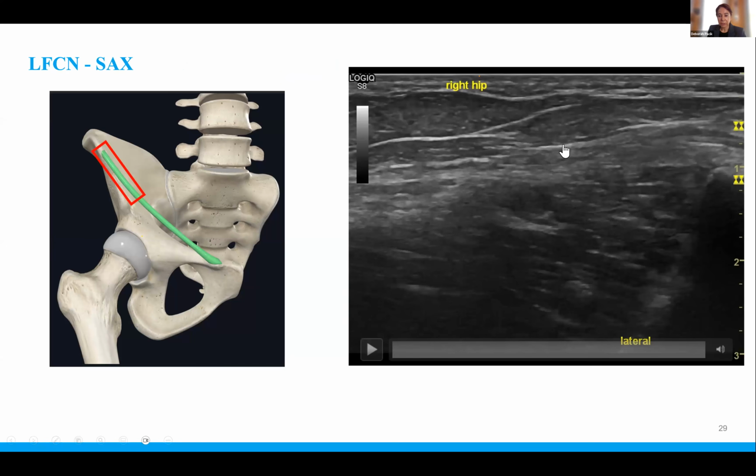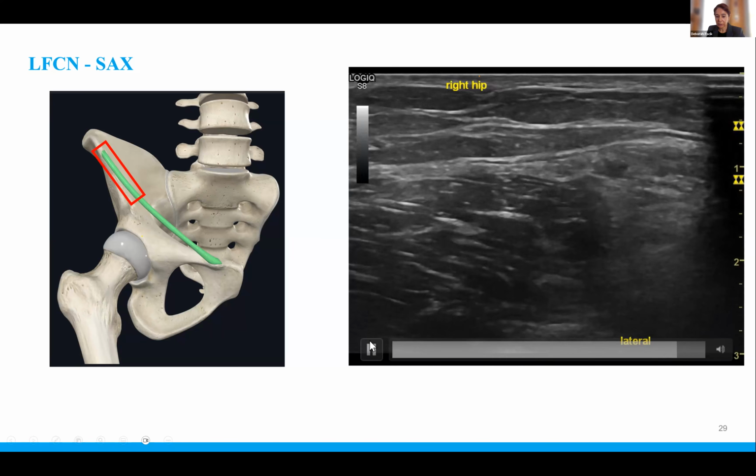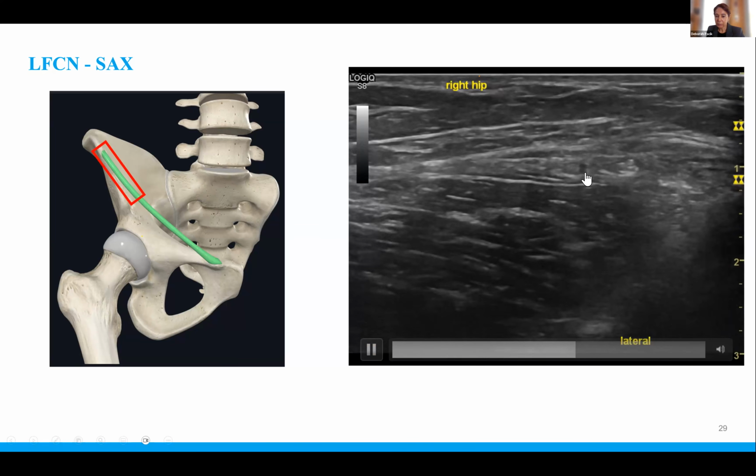When we want to really start focusing in on the nerve, it's good to start in long axis to the inguinal ligament. Depending on the variability of the path, you can either stay in this long axis to identify the nerve in short axis, or you might turn the transducer to have the inguinal ligament oblique. It kind of depends on the path of the nerve. Here we're scanning with the inguinal ligament in long axis, and we see the nerve right here coming up, up, up, up, up.